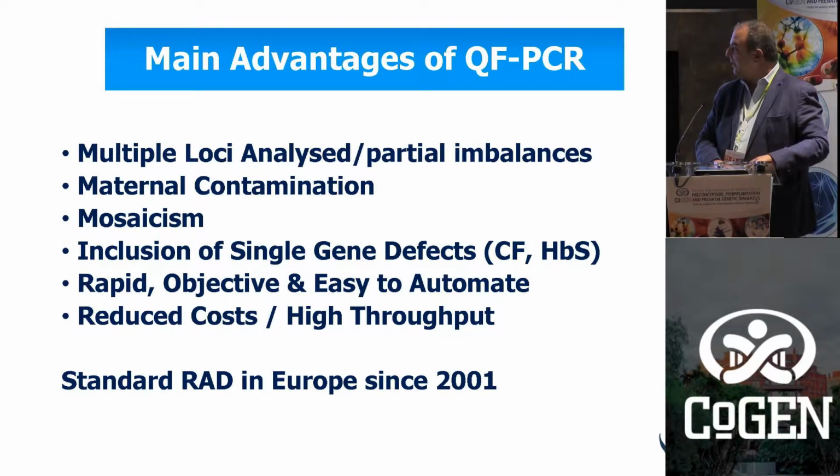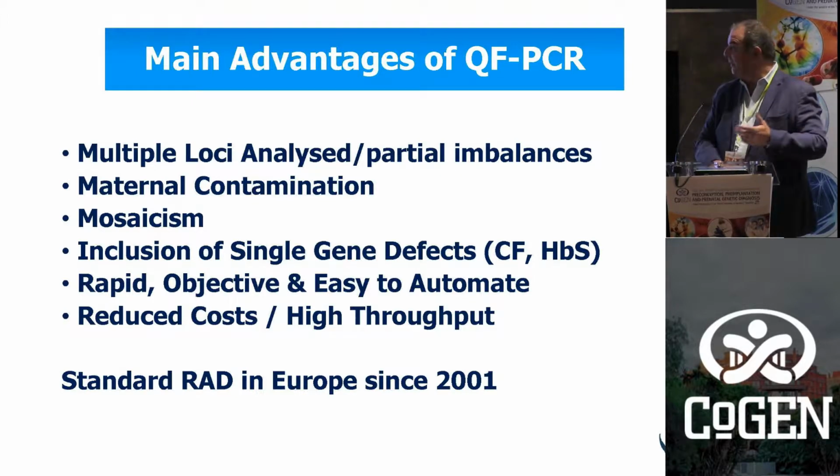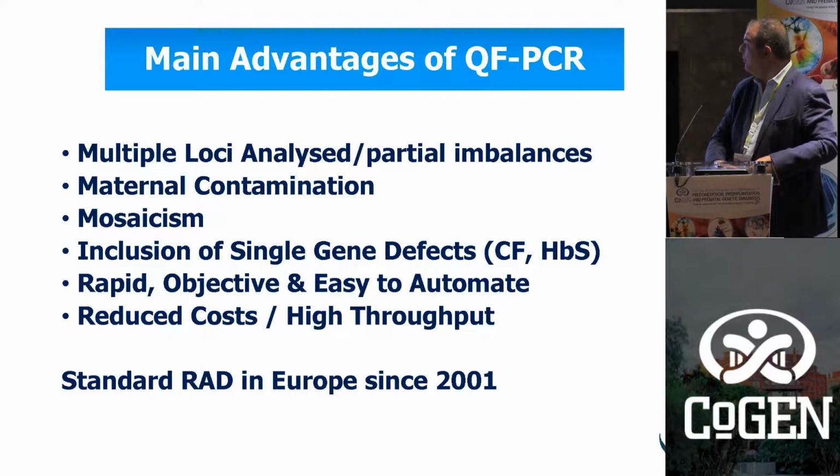It is totally objective in interpretation, as it is computer software analysis, easy to automate, so it allows high throughput and reduced cost, and actually this has been almost the standard for rapid aneuploidy screening in Europe since 2001.